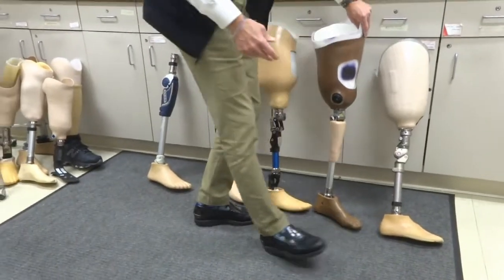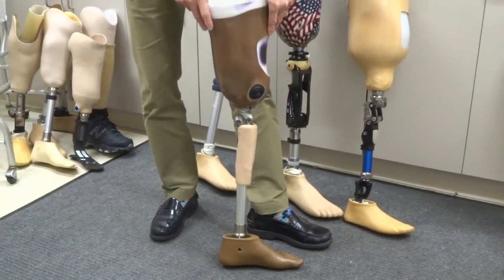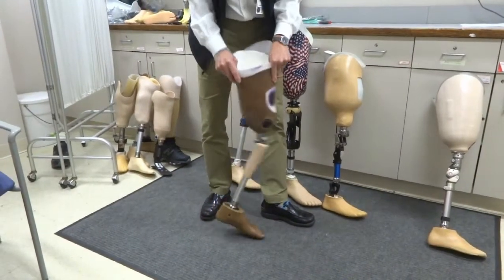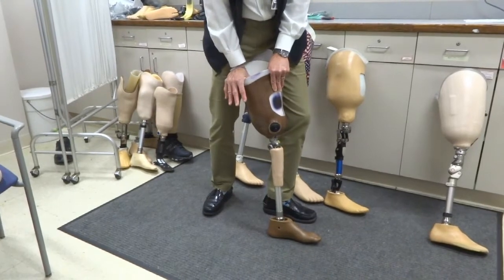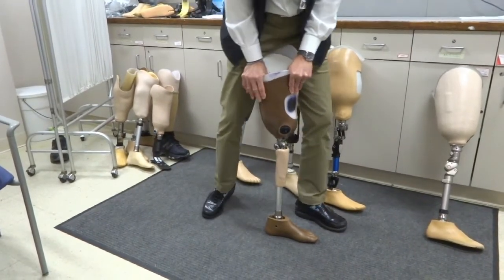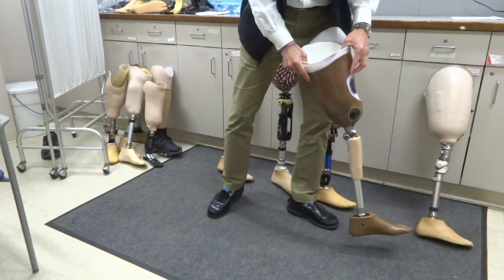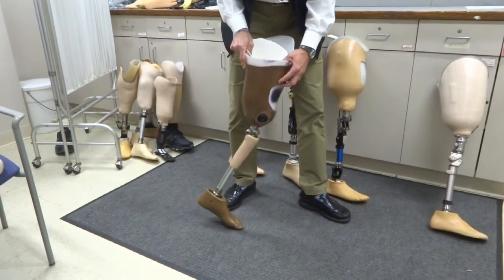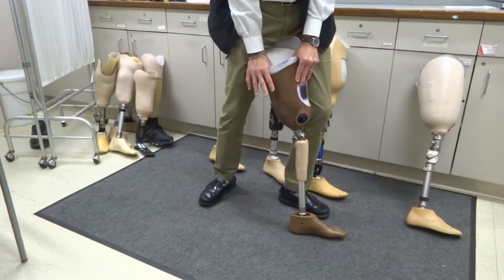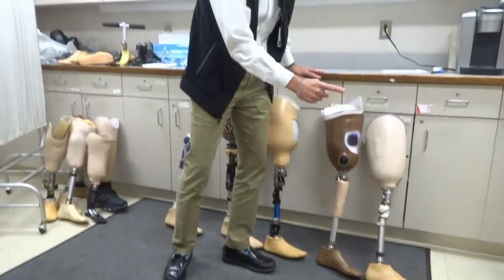The second prosthetic knee, available for category one or category two — those who walk indoors and a little outdoors on primarily level surfaces — is called a stance control. A stance control is a weight-activated locking mechanism. When there's no pressure on it, it bends easily because it swings freely. But as soon as you hit the ground and put weight onto it, the knee locks. As long as you put roughly 20% or more pressure on it, it stays locked. Once you get to the toe and start lifting your weight off, that starts the bending process and then it swings — it's spring loaded, so it kicks all by itself.